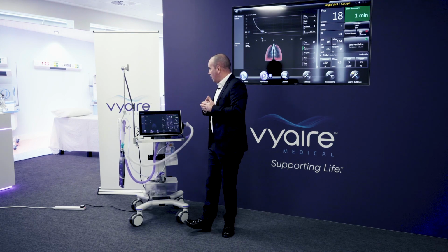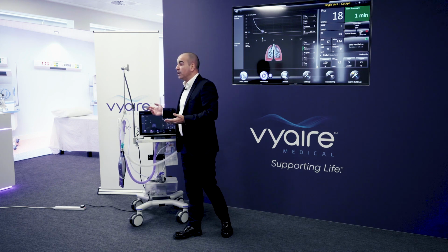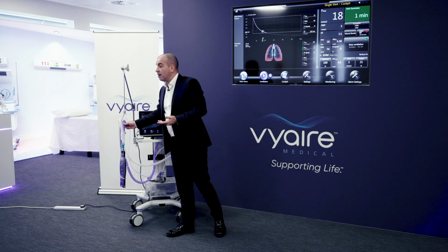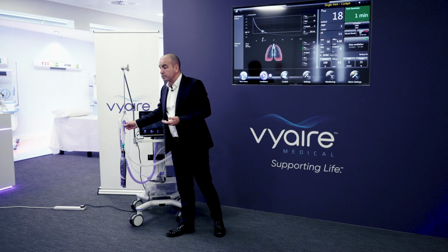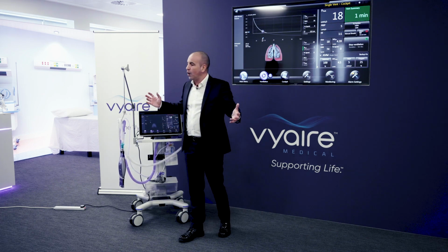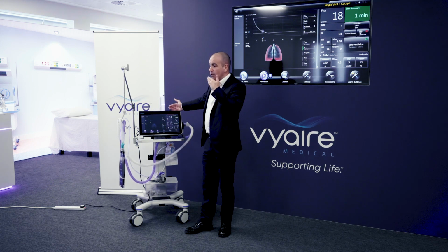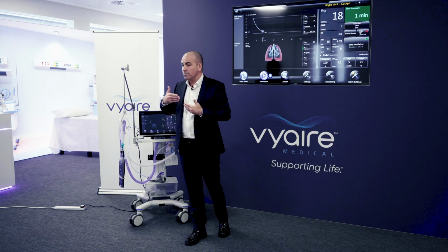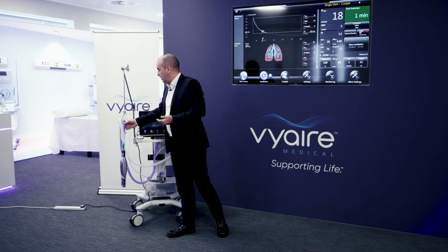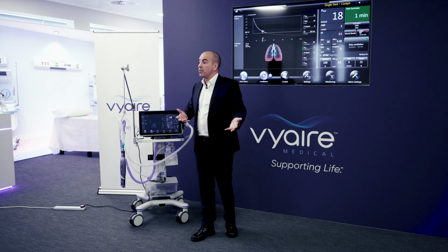In terms of the infant patients that you may well put onto here, we can use our infant flow LP consumables. We can use our infant circuits, our infant air life circuits, so you can put those on there as well. So there's a lot of crossover and tie-in there that we can do, as in bringing our whole One Vyaire offering together. Because between the four feet from the vent to the patient, we can drop in our Verso closed suction system. We can put in our bypass HMEs, or we can use our circuits. So there's a lot of opportunity there for us in order to share the quality products that we have.